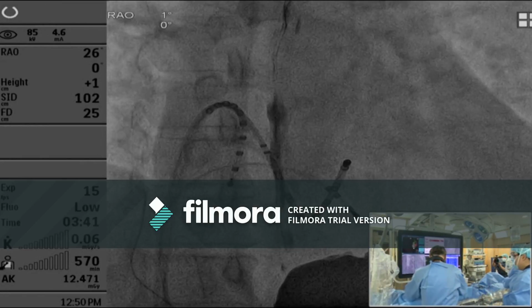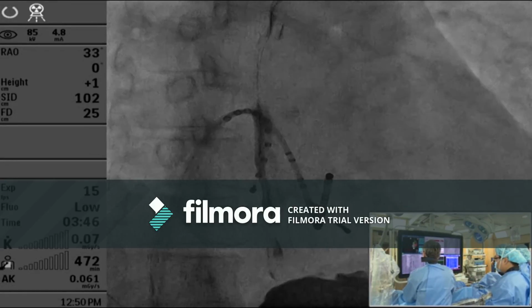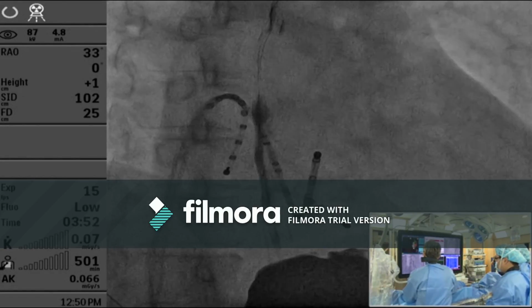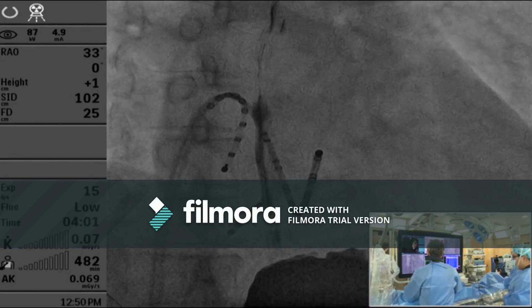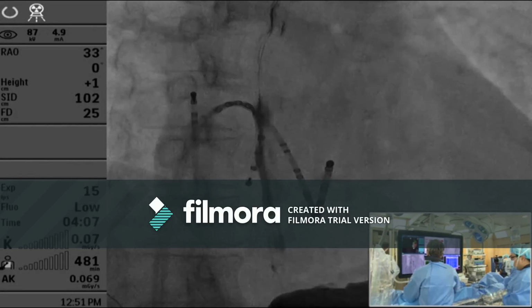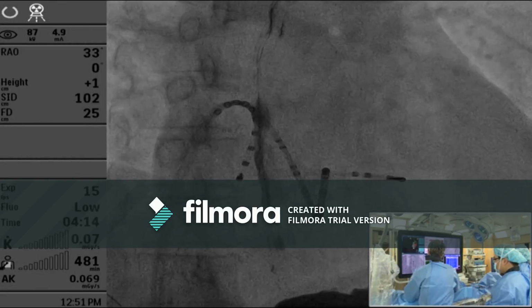This is our usual position of the catheter on the fluoroscopy. The RAO 30. Okay. This is the duodeca halo, the one decapolar at the CS, and the quadripolar in the RV. Sometimes we move this quadripolar to the SVC to identify non-PV foci like the SVC. So this is our common catheter position before the transseptal.